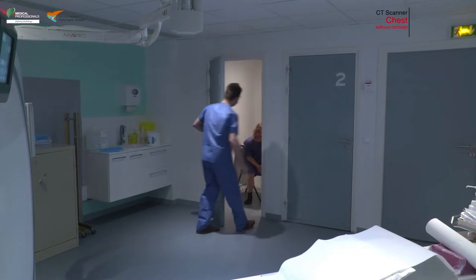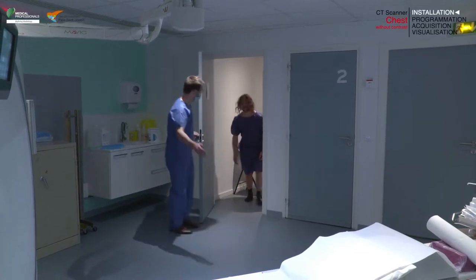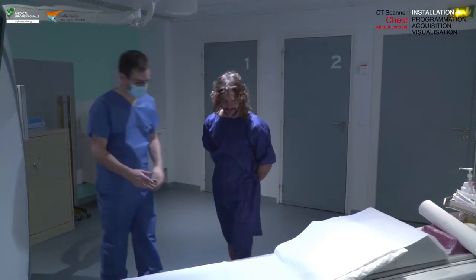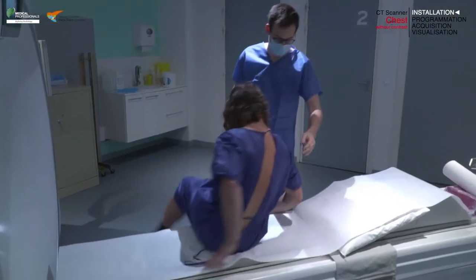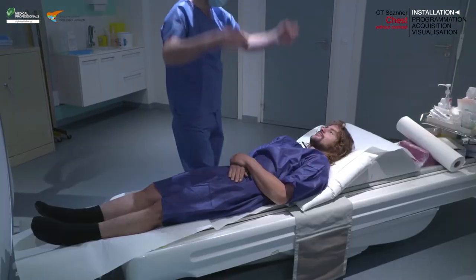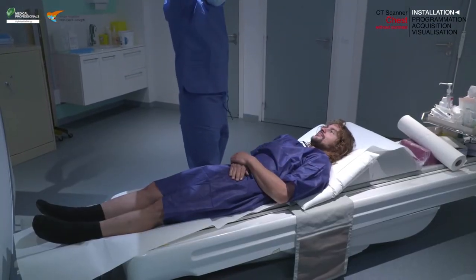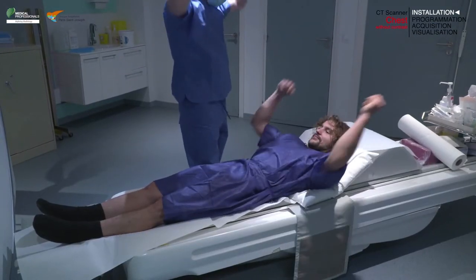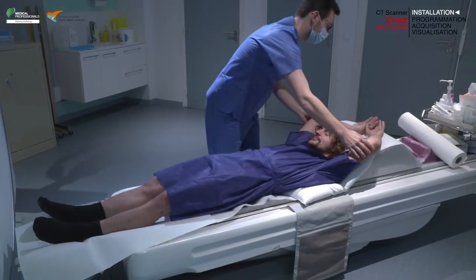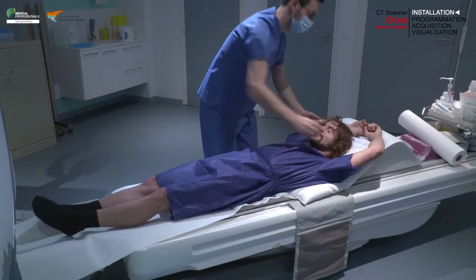Once you have verified the patient's identity using at least two identifiers, such as first name, last name, and date of birth, place your patient in a supine position with their arms above their head.